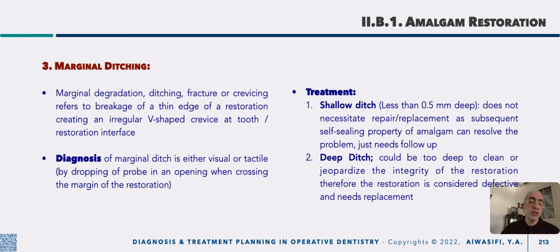without any pressure. Take care not to force your explorer at the margin. It will actually produce marginal ditching. If it is not present, it will be present. And at this time, after trying this, I will re-examine it. If I am satisfied, it's okay. If I'm not satisfied, I will replace the amalgam again, either by another amalgam or by any other restoration.